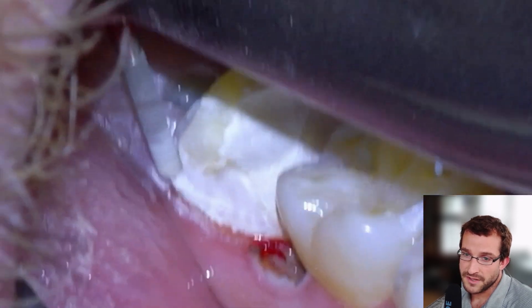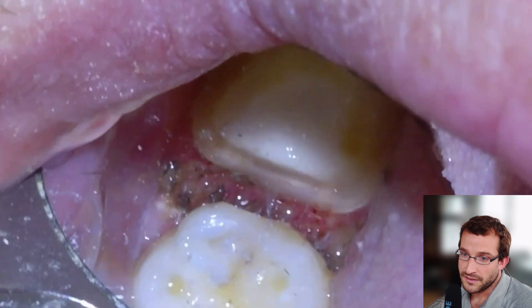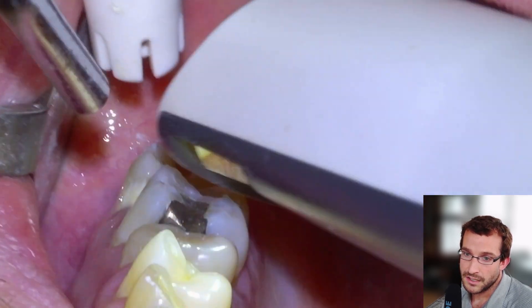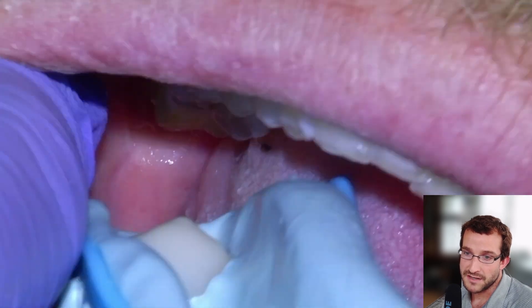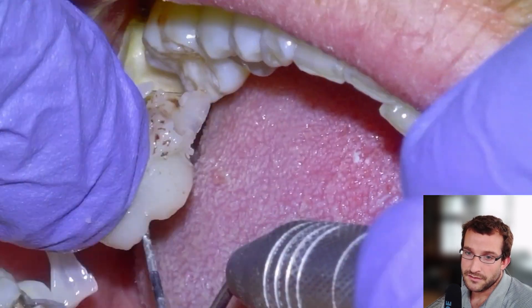They're obviously going to have pain from the gums from the gingivectomy, so we'll give them Advil and Tylenol anyway. There's our prep — we're going to get a scan and then put a temporary on it, which is optional for a situation like this. Basically the temporary is just for space maintenance, which we did do here.